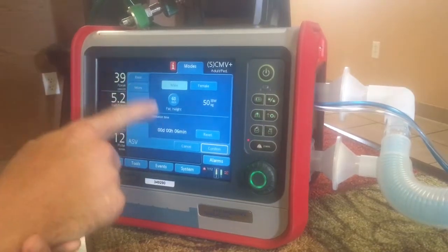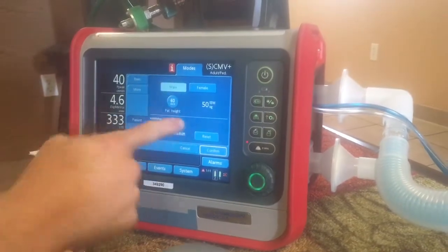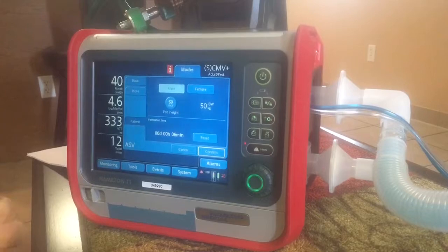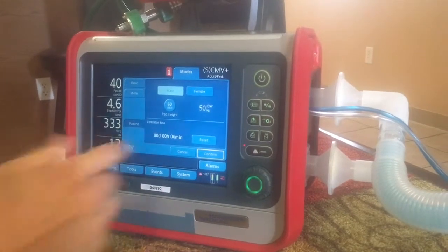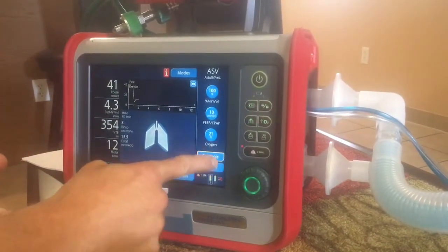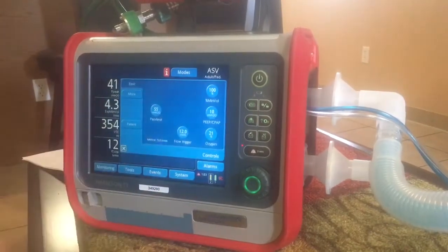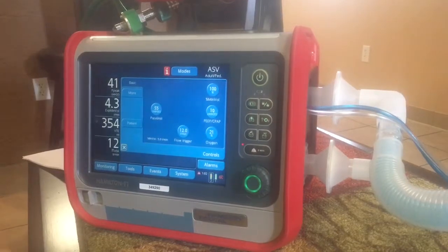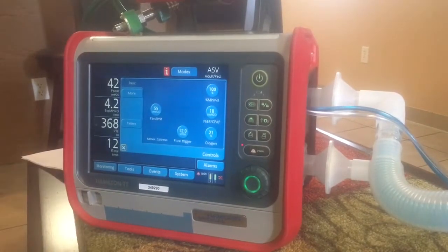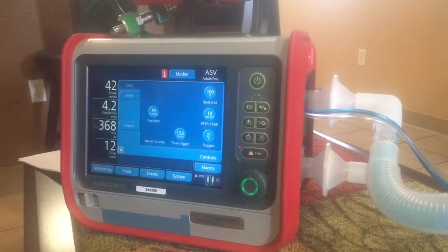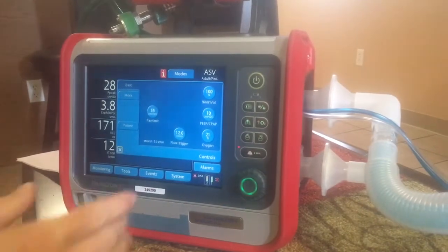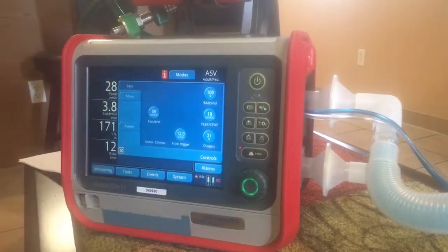Right now we want a male patient with 60 inches, which is going to give us an ideal body weight of about 50 kilograms. We want to confirm that. Then we're going to go to controls. One unique thing about ASV is we don't set a respiratory rate and we don't set a tidal volume.